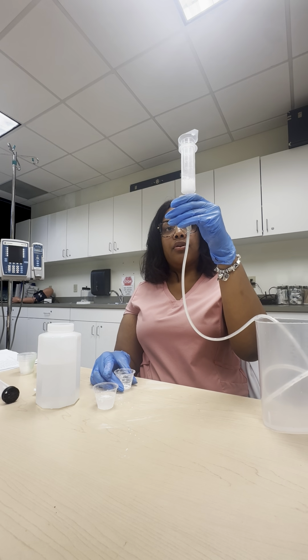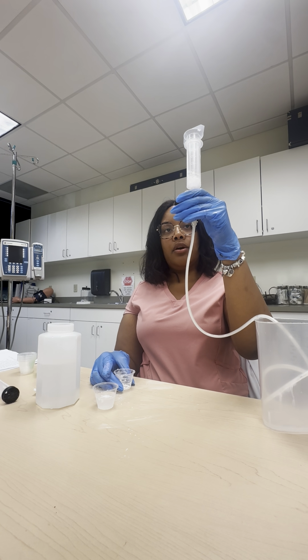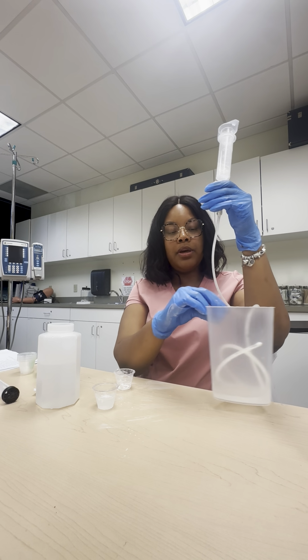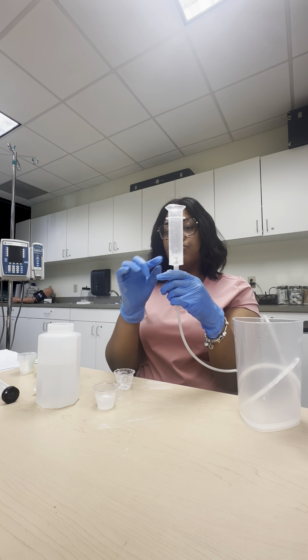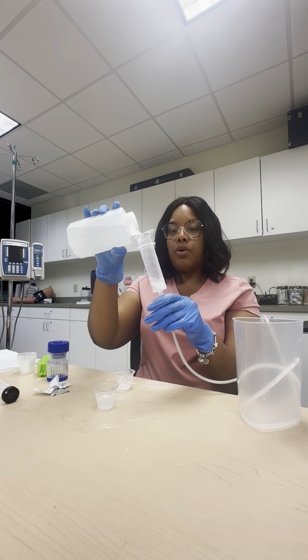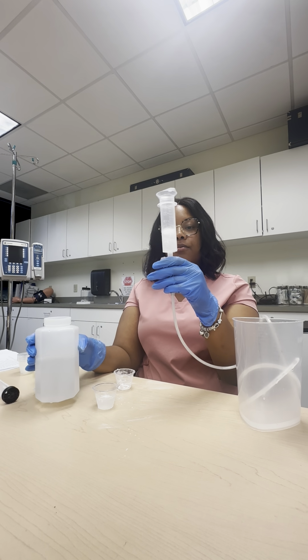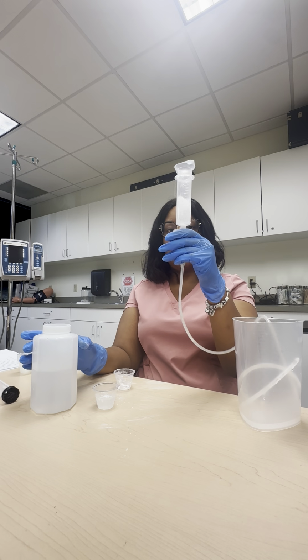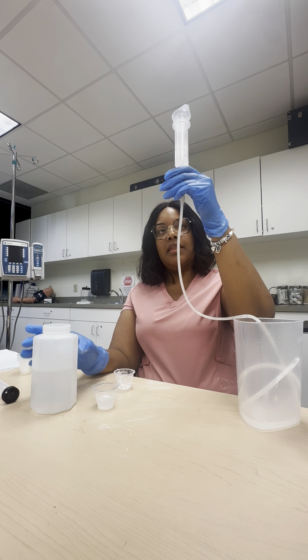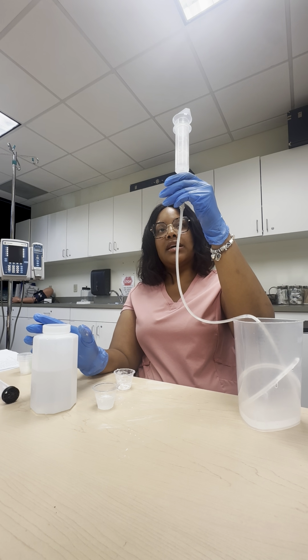And then we're just going to hold it up and wait till it goes down. This is a longer peg tube, so it takes a while to go down. We see we got some residuals right there. I'm just going to put a little bit of water in there to get it off the sides and shake it around, and then it's flowing, it's flowing, it's flowing. That's just to get the rest of the medicines out.